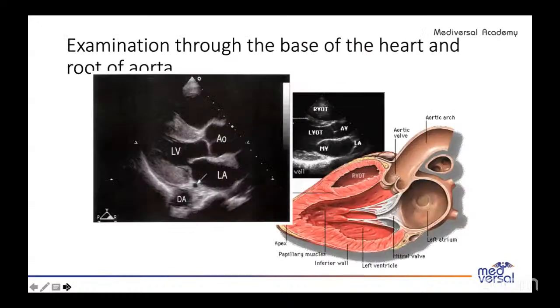So next, this is the parasternal long axis. Just see it clearly. This is how it is made. You have seen the marker is on the right shoulder, and the transducer is between the second and the fourth intercostal space on the left side.